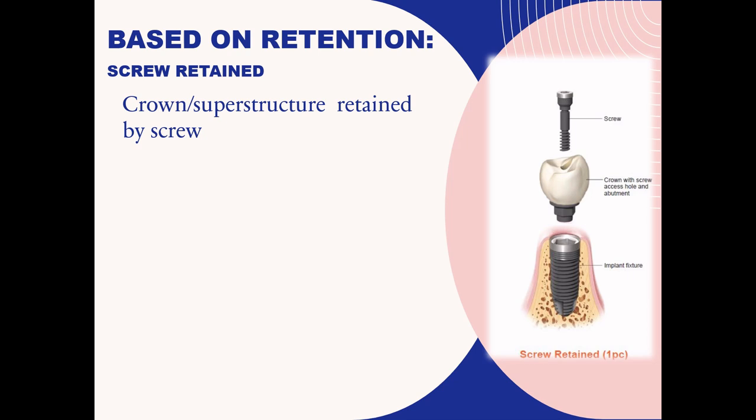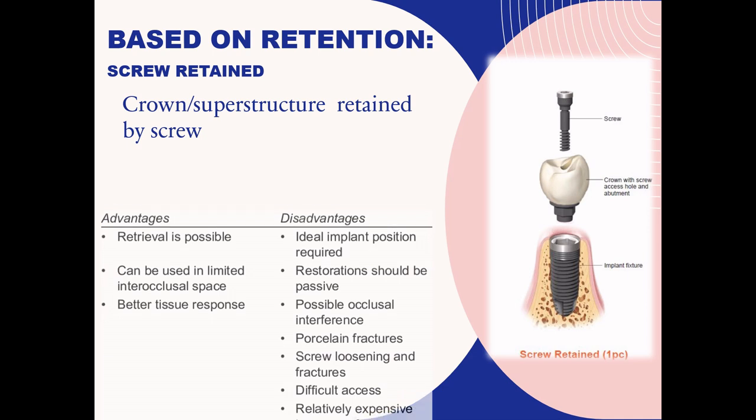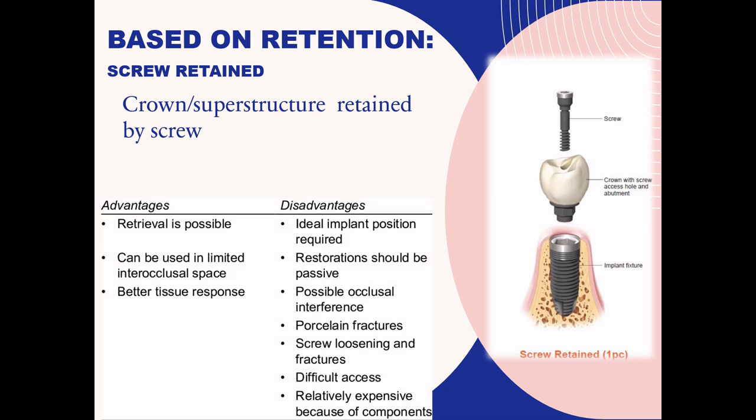in the restoration where we fit the screw, and this hole is usually filled with composite that blends with the restoration. And the advantages of screw retained restoration is easy retrieval is possible. It can be used in limited interocclusal space.